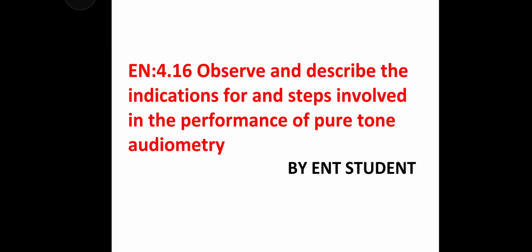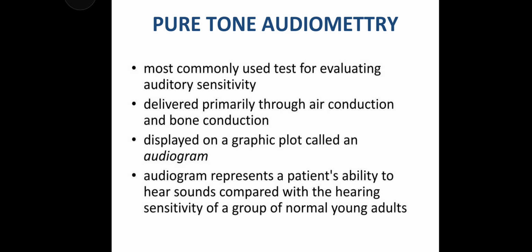4.16 about pure tone audiometry. Pure tone audiometry is the most commonly used test for evaluating auditory sensitivity, delivered primarily through air conduction and bone conduction, displayed on a graphic plot called an audiogram.